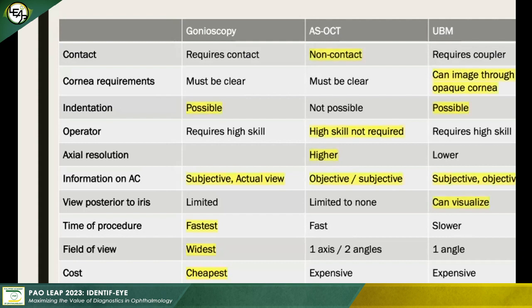So weighing all their relative pros to each other, here we see that gonioscopy clearly has most of the benefits, not all. You have the benefit of having a wide angle. You have direct visualization. It's fast. It's relatively cheap, and it gives you the most accurate information.